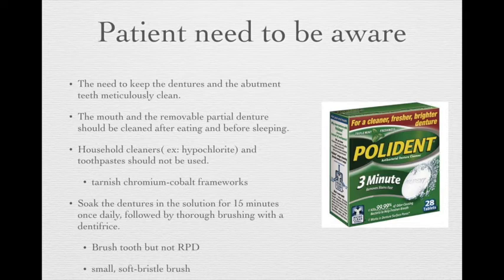Patients also need to be aware of the need to keep the denture and abutment teeth clean. They should clean after eating and before sleeping. For RPD cleaning, they shouldn't use household cleaners like hypochlorite or toothpaste on the RPD surface, because hypochlorite may tarnish the chrome cobalt framework, and toothpaste has abrasive material that may hurt the smoothness of the denture base surface.